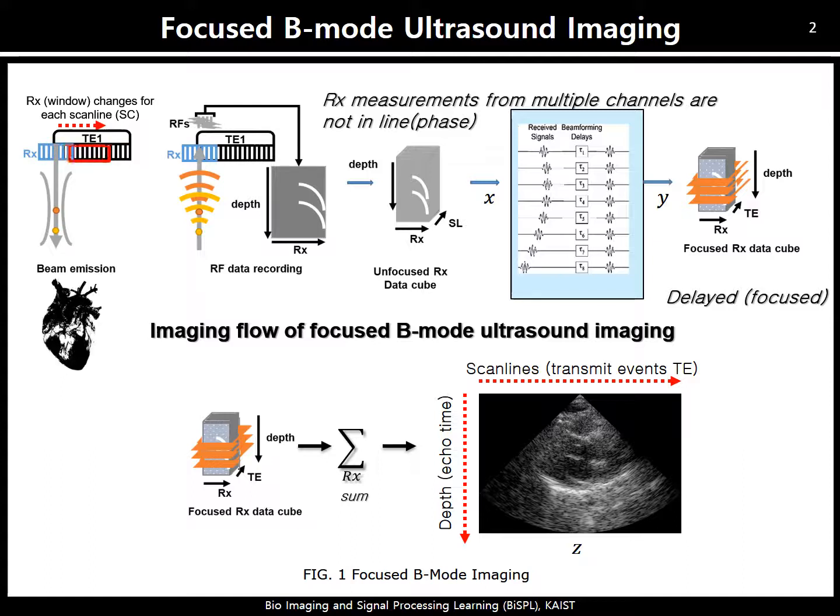The basic imaging principle of ultrasound imaging is based on time reversal, which is based on the mathematical observation that the wave operator is self-adjoint. In other words, the wave operator is invariant under time transformation, and the positions of sources and receivers can be swapped.